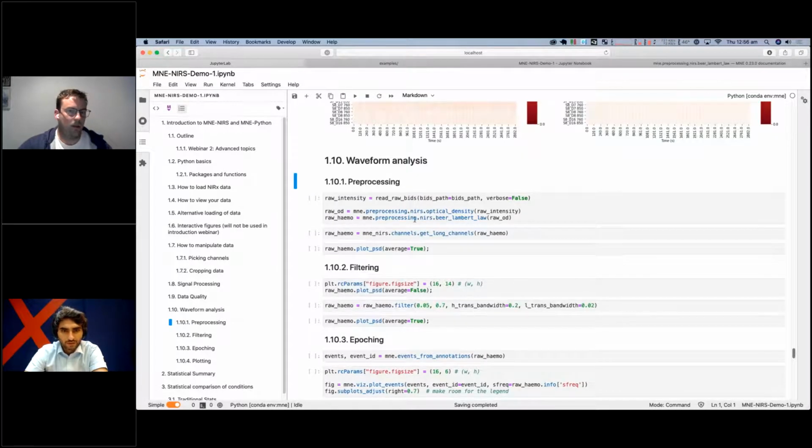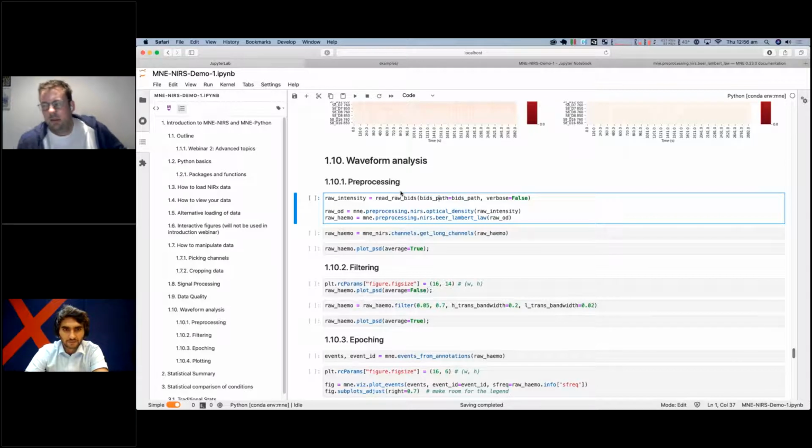There's one more question, if I may ask, on scalp coupling index, since you mentioned it. Just a consideration that SCI should be used along with the peak spectral power metric to assess the quality. The SCI accuracy could be affected if motion artifacts exist in a channel. So, yep, that's less of a question and more of a point out.